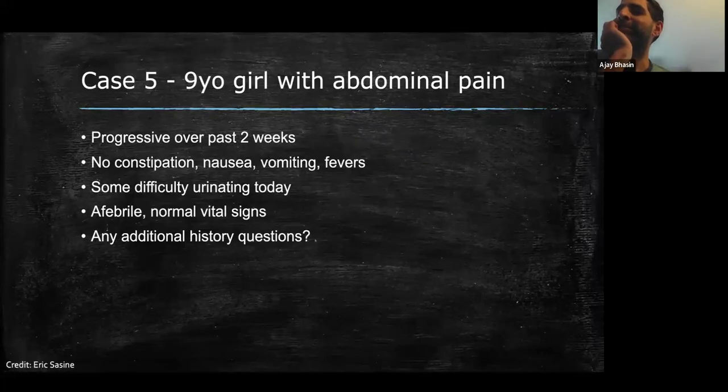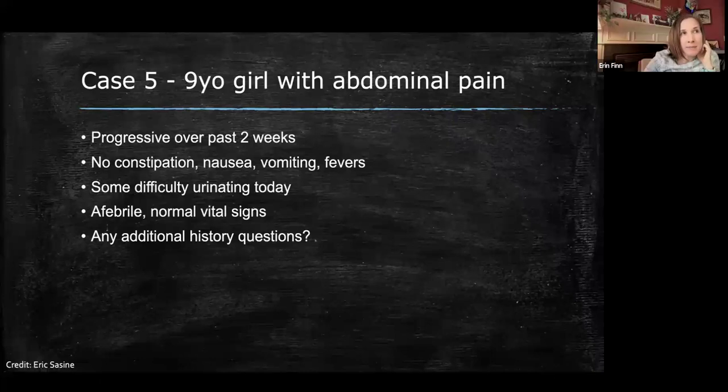Emily's asking, is there pain or burning urination or pain in the back? Yes, some pain in the back, but kind of dull and not specific. And then she's having a little bit of difficulty urinating. So she doesn't say specifically that it's burning or anything like that. But I'll show you this. The ultrasound will help.